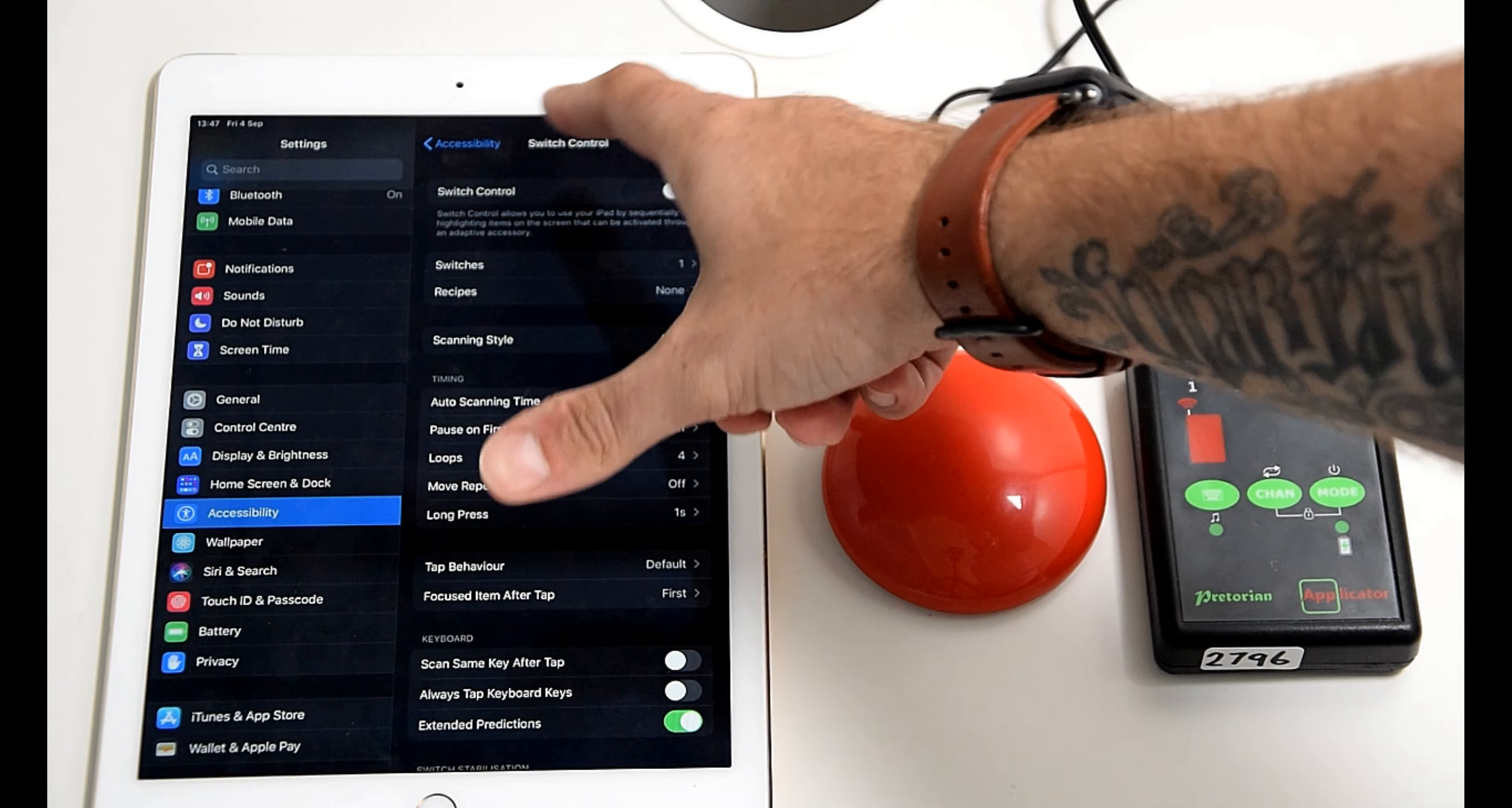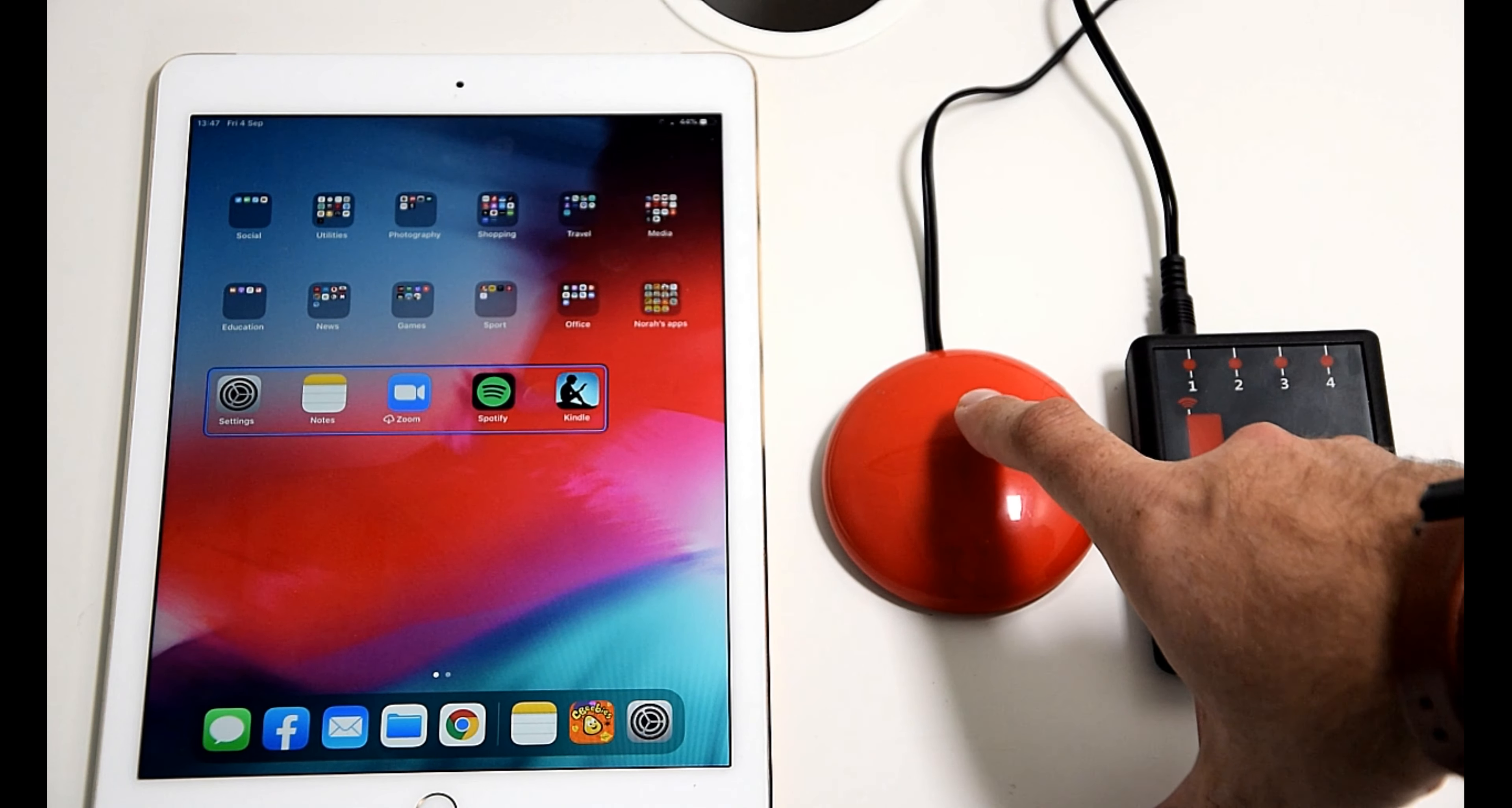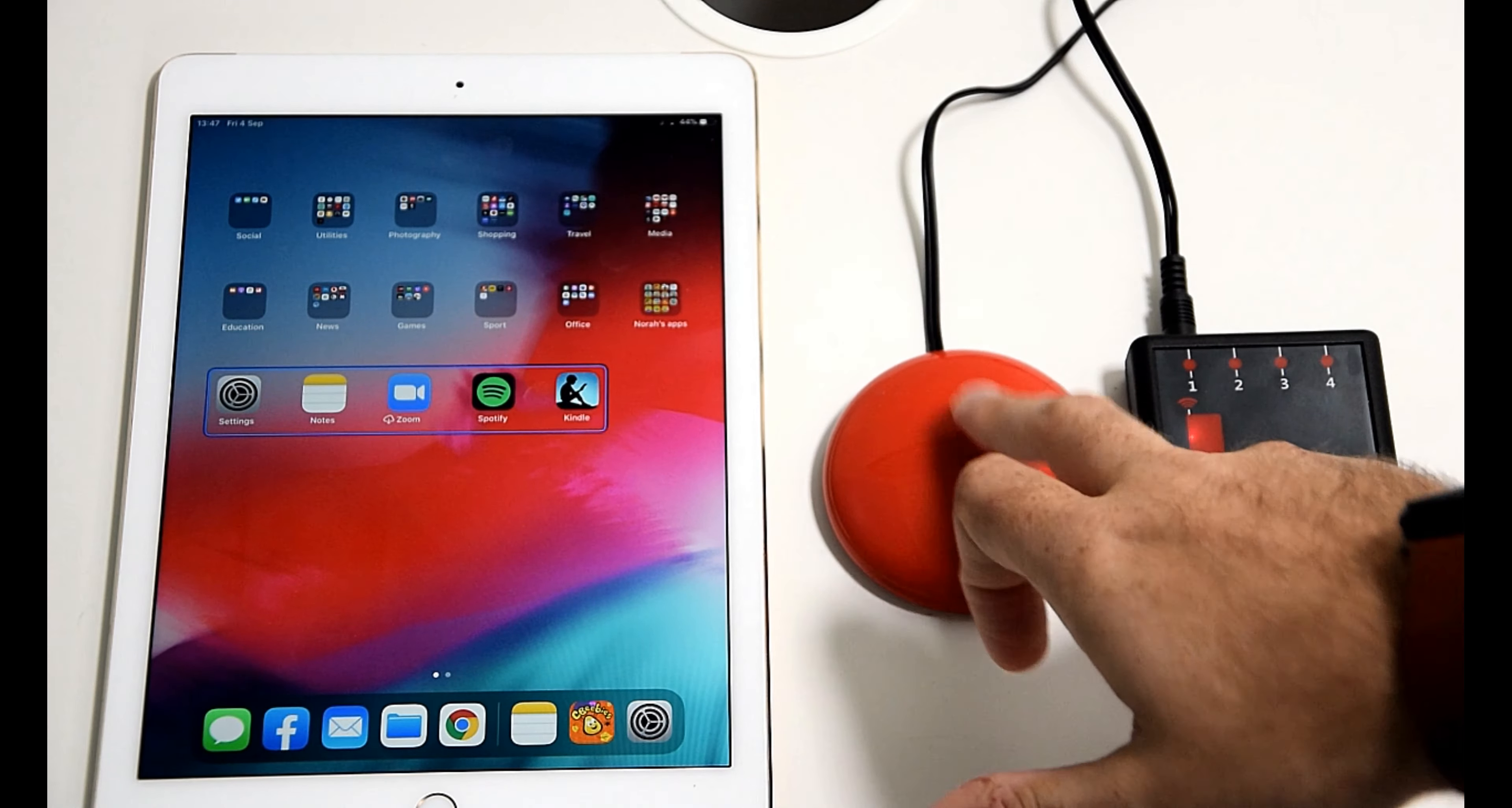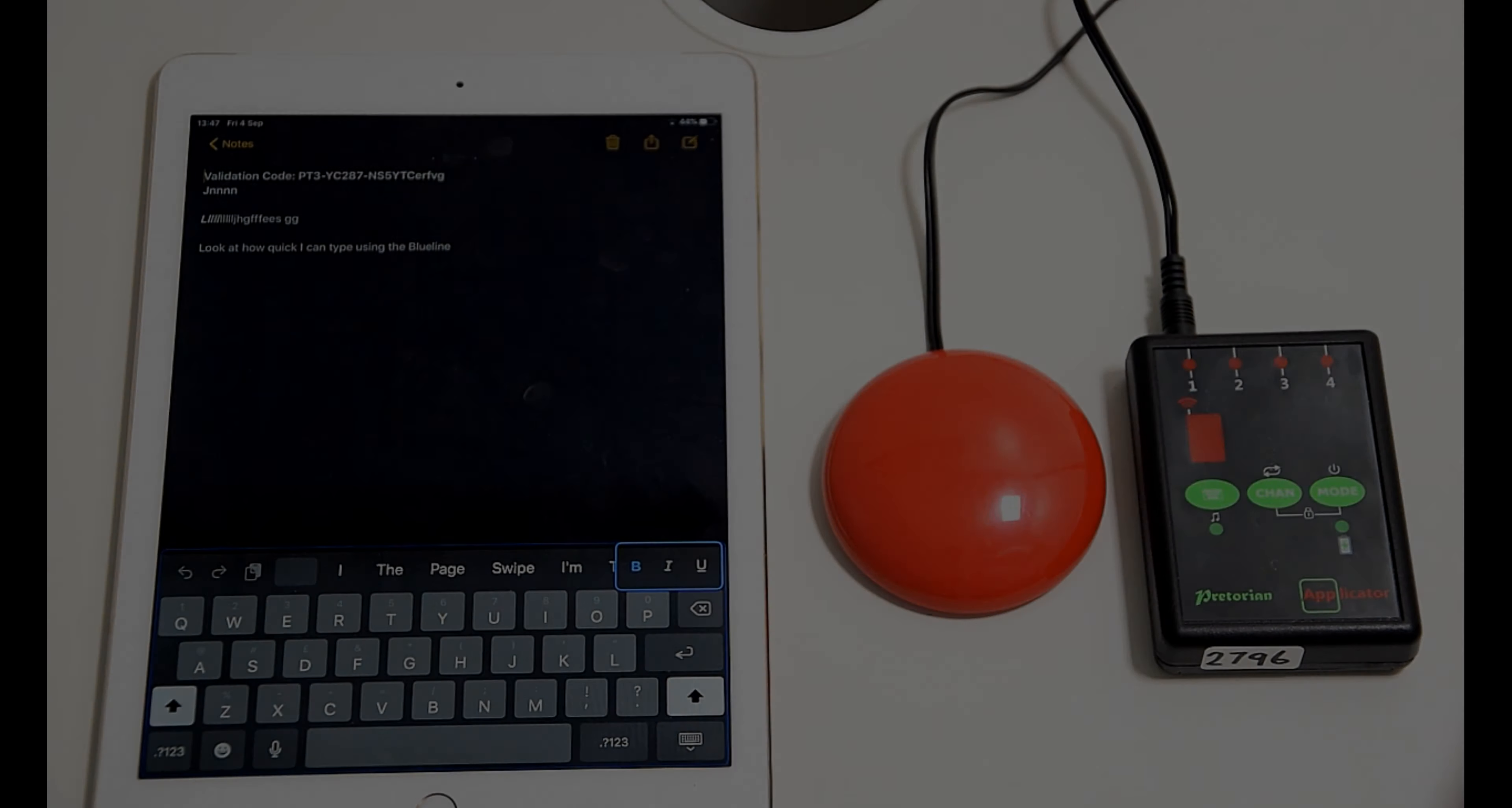So what we'll do is we'll turn switch control on and show you how it works by pressing home. It'll auto scan across the menus with the blue bar and it'll go right down to the bottom and across different things, going two seconds at a time each time you see it move between different boxes. When you're ready to go into one you press the switch, and then when you select your app you can go into your app like that. So auto scan is as simple as that.